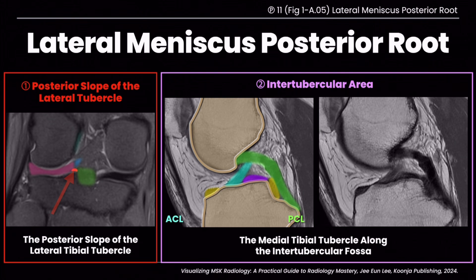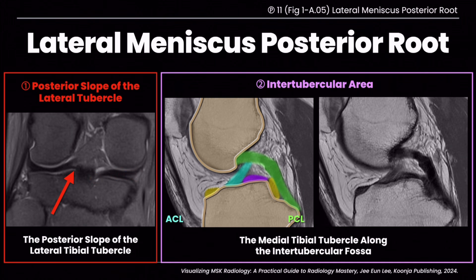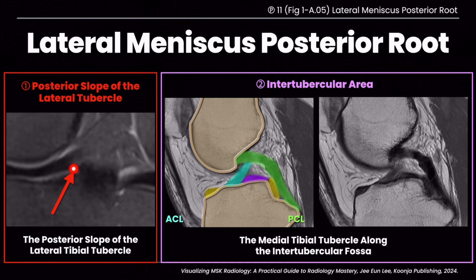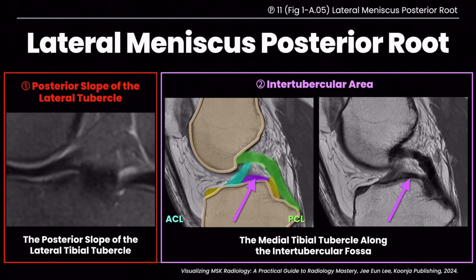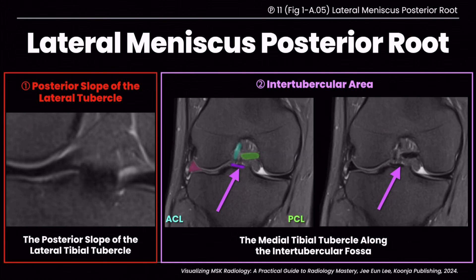The minor component is best seen on coronal images, and like the posterior root of the medial meniscus, it's a short ligament that appears briefly on just one cut in the coronal image. The major component, located in the intertubercular area, often appears on sagittal images as a thin, low-signal band running parallel to the tibial plateau. It courses anteromedially from the posterior horn of the lateral meniscus along the intertubercular crest, and compared to other meniscal roots, it appears longer and less striated. On coronal views, look for small, dark foci crossing the intertubercular crest — these fibers anchor near the medial tibial tubercle, appearing as tiny dots or short bands traversing bone.